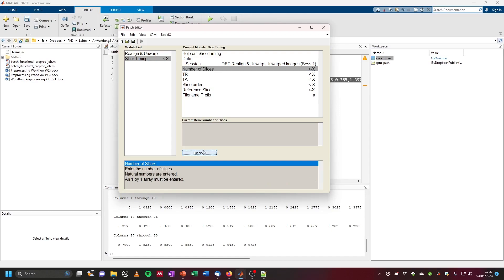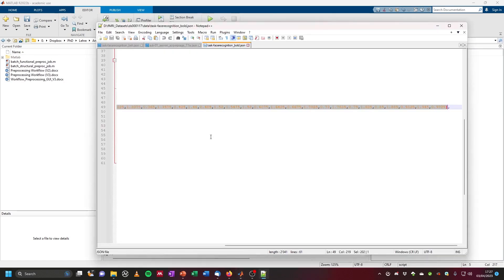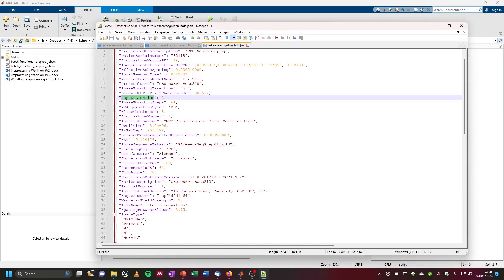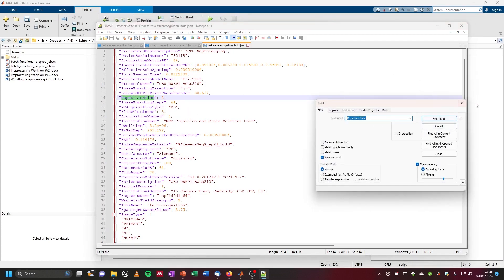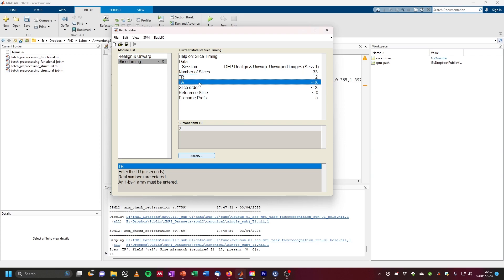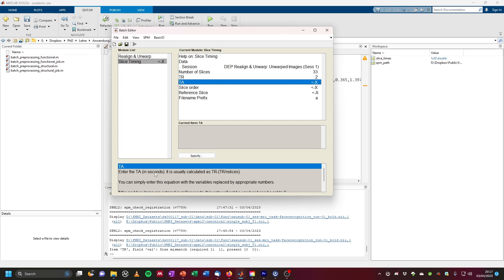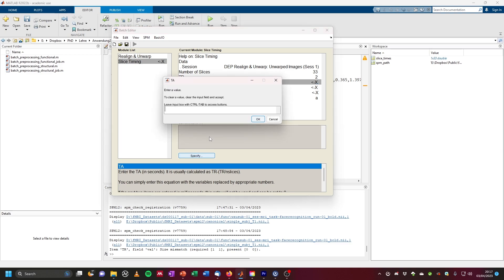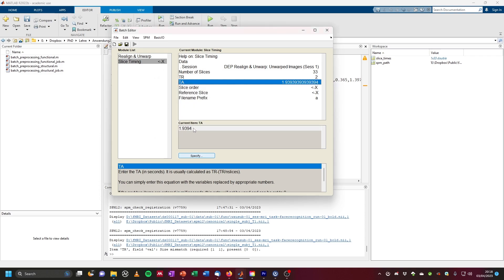So we can already say the number of slices is 33. The TR is also specified in our JSON file under 'RepetitionTime' — in this case it is 2 seconds, so we put in 2. The TA (acquisition time) is calculated as TR minus TR divided by the number of slices. We can do this calculation: 2 minus 2 divided by the number of elements of the slice_times vector (33), and this calculates the TA for us.